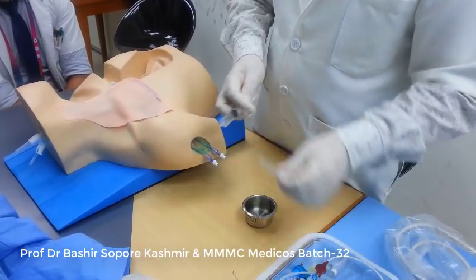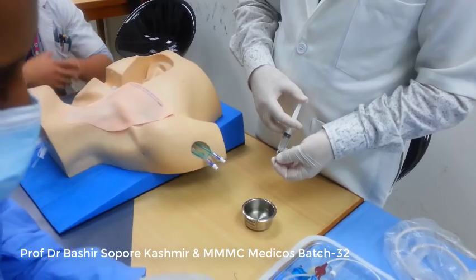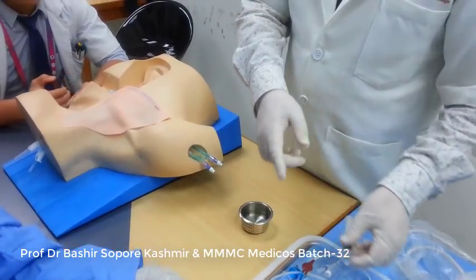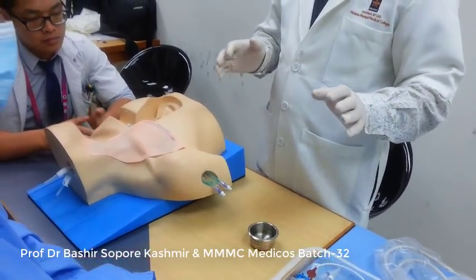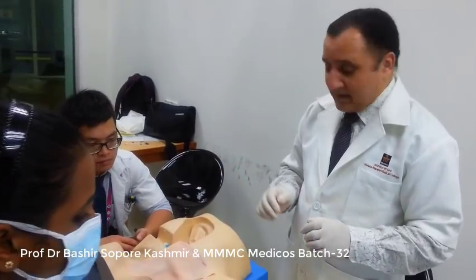Then I take another needle and check it. So this is also patent. So I am checking the guide wire, I am checking the catheter, I am checking the syringes, I am checking the needles. Everything is patent, so I am satisfied.